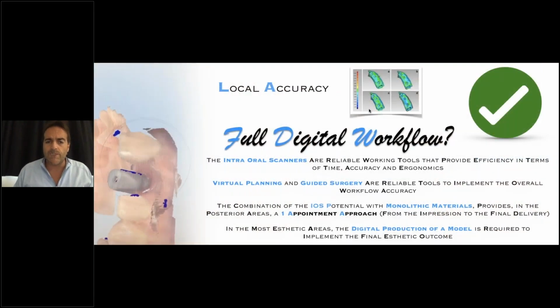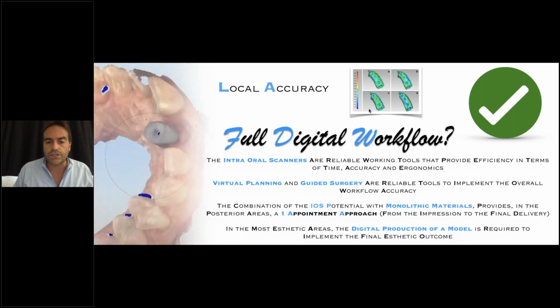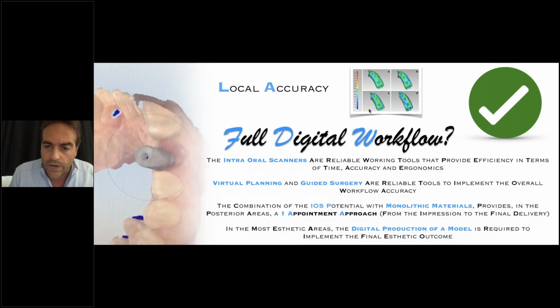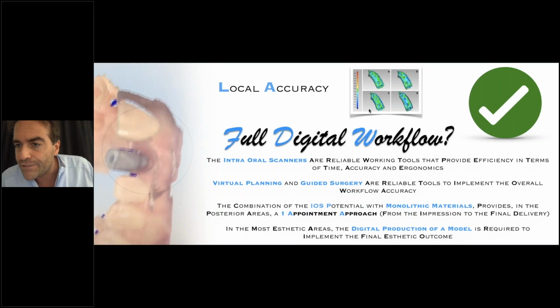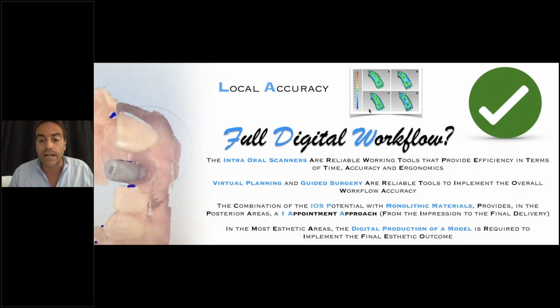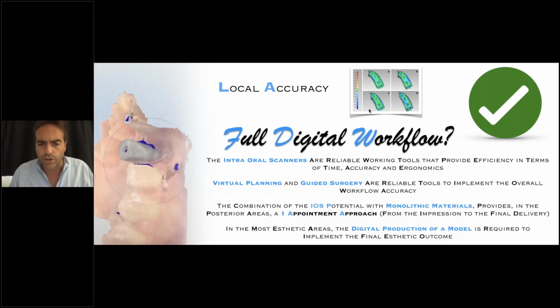So, making a long story short and trying to give you an answer on local accuracy, for sure we can have full digital workflows, because intraoral scanners right now are reliable working tools that provide saving of time, accuracy, and ergonomics. Virtual planning and guided surgery are extremely reliable tools to improve workflow accuracy.